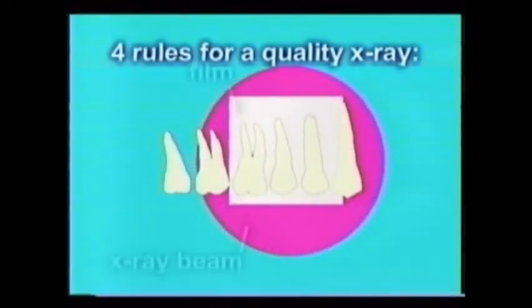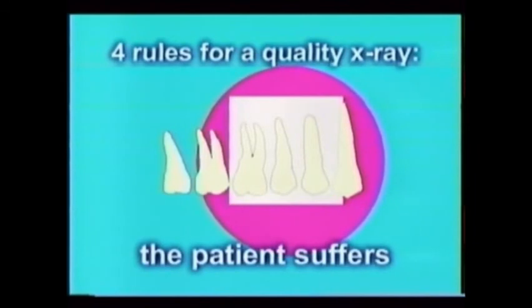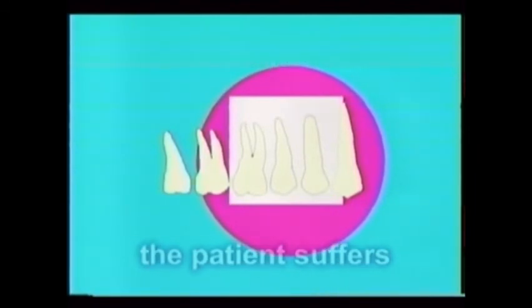Finally, the teeth must be centered in the beam to avoid a cone cut error. Otherwise, a retake will be required, and who suffers? The patient suffers. All of these errors will be demonstrated at the end of this film.